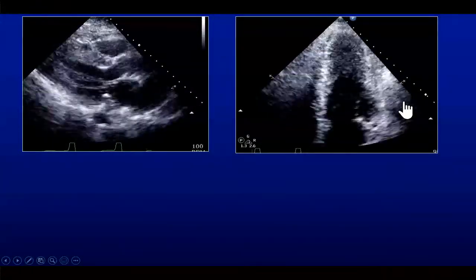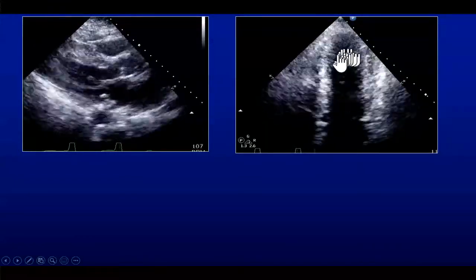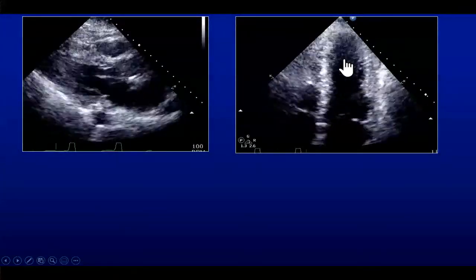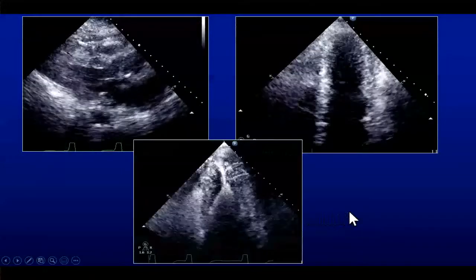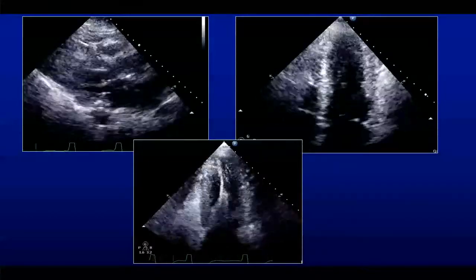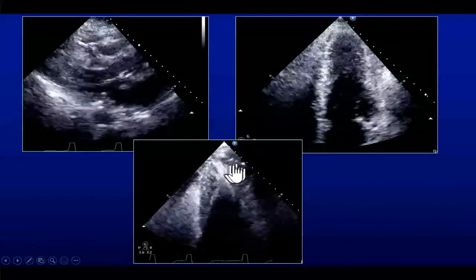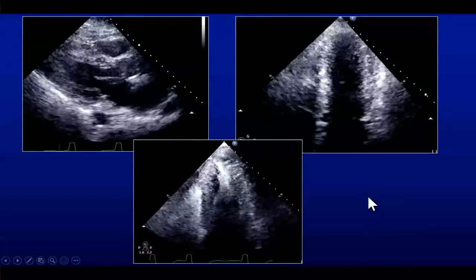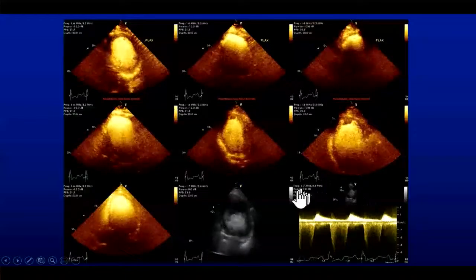Usually it comes in about 10%. And in this situation, it would be either akinesis of the apex or too much crowding, right? Meaning too much hypertrophy so that you won't have anything going on there. And indeed, that's what you see. You see a nice apical hypertrophy, and actually you can see the arterioles that are coming in and feeding. It's amazing, really a very nice depiction of it. Okay? So remember a few things.